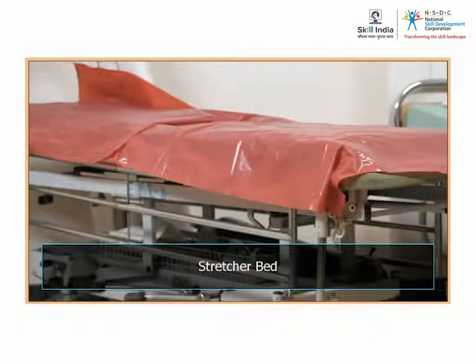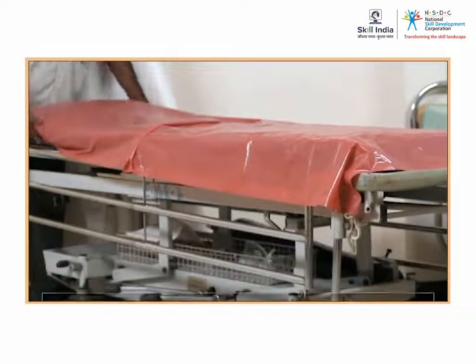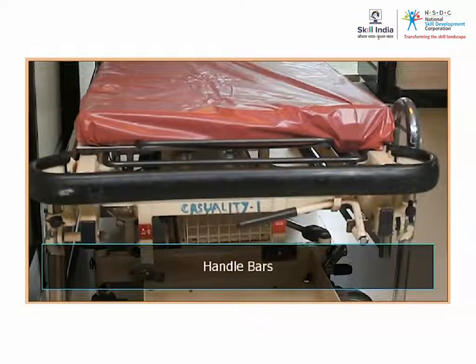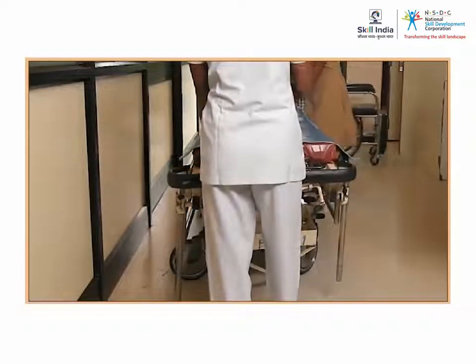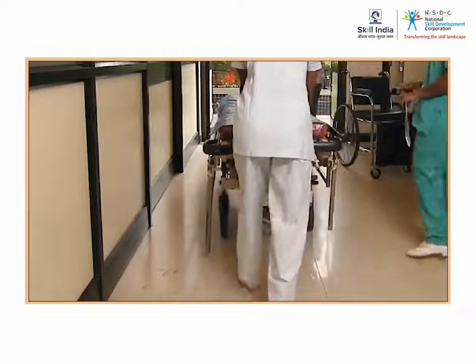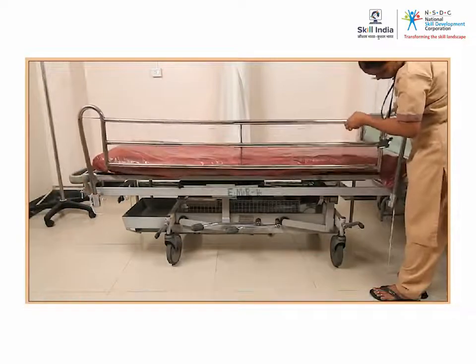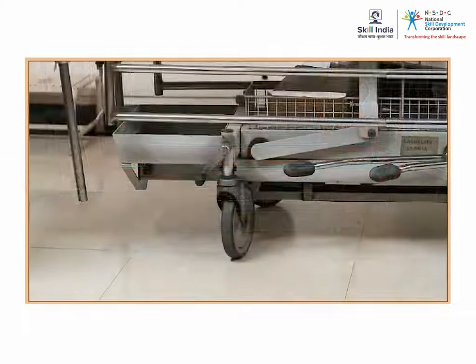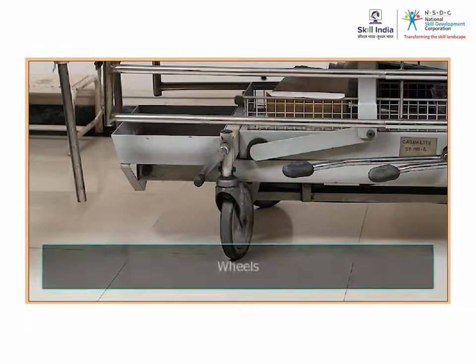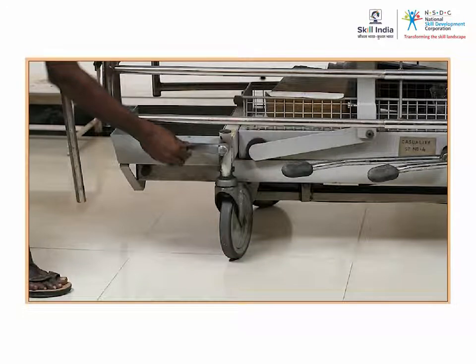The stretcher bed is a flat area with a thin mattress on which the patient is placed. The handlebar is located on one side of the stretcher and is used by the assistant to hold and push the stretcher. The side rails of the stretcher prevent the patient from falling off from the side and ensure the safety of the patient. The stretchers are provided with wheels with rubber covering for smooth movement. Wheel locks prevent the movement of the stretcher while the patient is transferred.